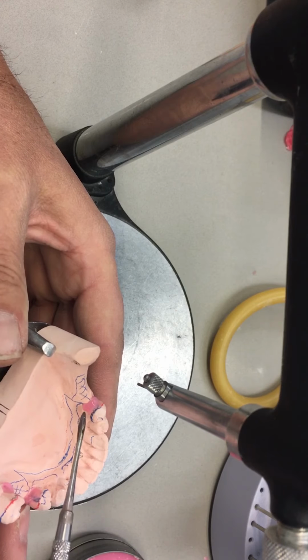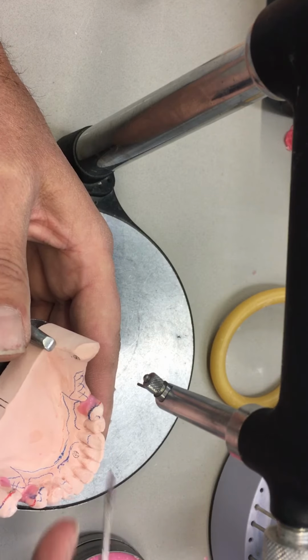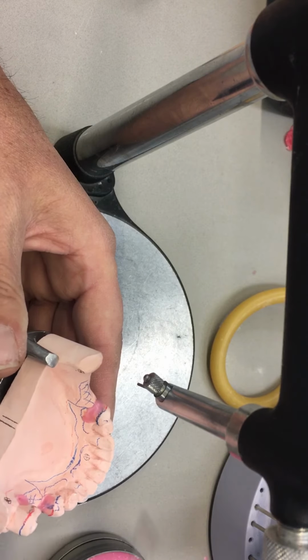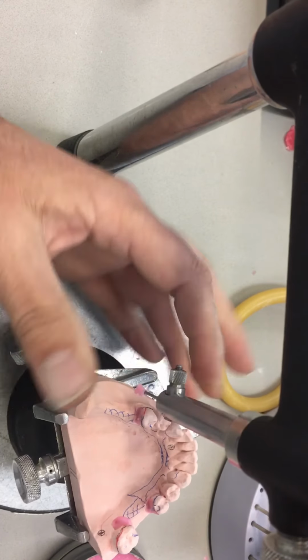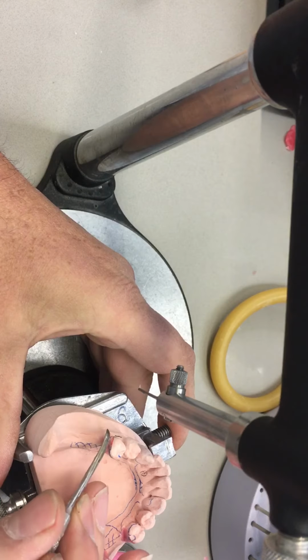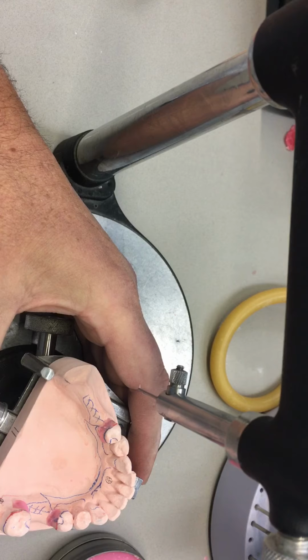If you're doing any aprons, though, for sure I would block those out with the blockout wax at the free gingival margin as a minimum, and I'll get around to that shortly. So I would do the guide planes with the surveyor, and then for the retentive arms and reciprocal arms, creating those ledges which will guide you in your wax-up, you could do that more freehand.